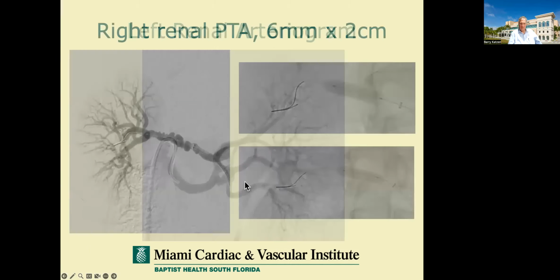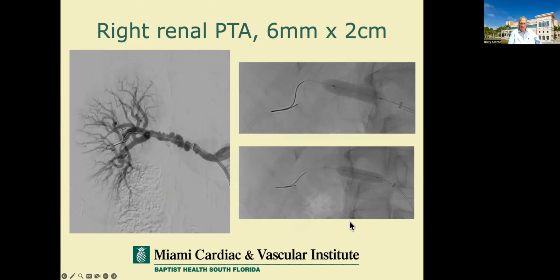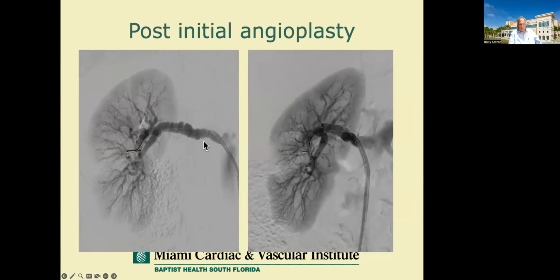Then we come back to the culprit artery, as you can see here on the right side. This particular case has a guide catheter and a small wire and a balloon placed. You can see the balloon in position placed into the area of FMD, and here's the guiding catheter that's demonstrated here. And here's what you can see afterwards. And maybe to your eyes, it doesn't look any different because we see this irregularity, but those webs that were going across the whole thing is gone.